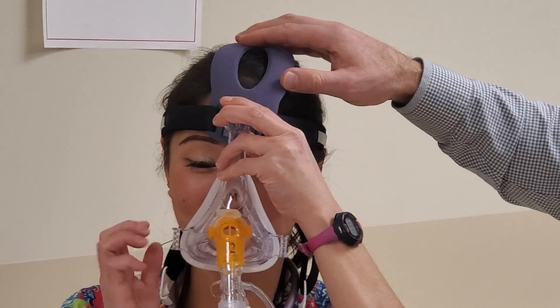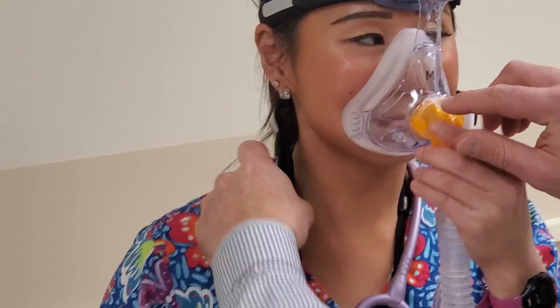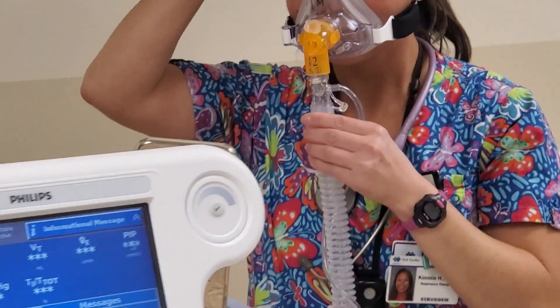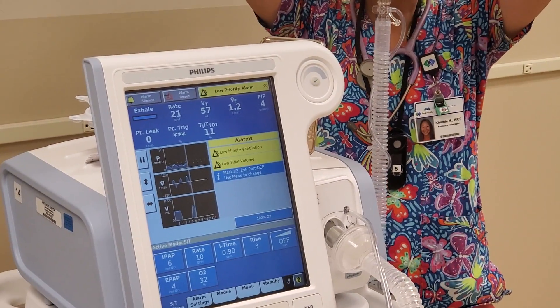We'll bring it back down and should be able to clip it on easily enough. The machine should start working again — it comes out of standby mode when it's connected.